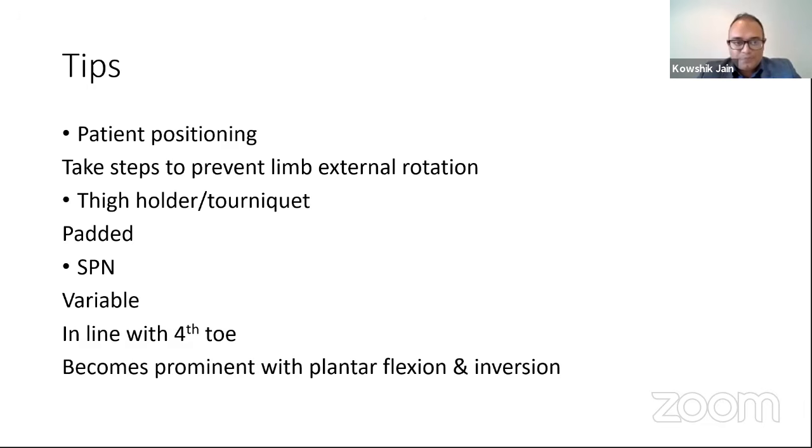So what are the tips when you perform arthroscopy? Like any orthopedic procedure, the more you do, the better you're going to get at it. This has become a common procedure in a foot and ankle surgeon's practice. Some of the tips which could help you: patient positioning.